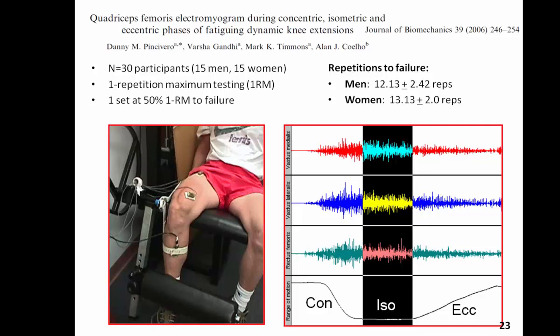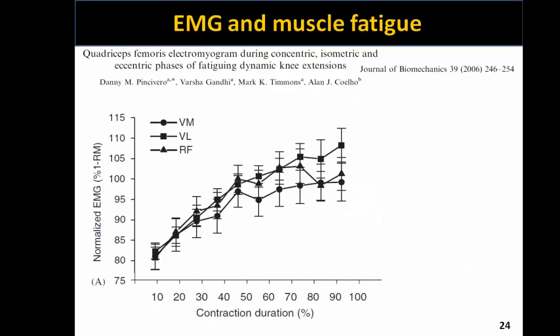So the first observation to make here is that we see a relatively large burst of EMG activity from the 3 superficial quadriceps femoris muscles as the knee goes through knee extension, held fairly consistent throughout the isometric phase, and we see relatively lower amplitudes as the weight is slowly lowered back to the start position because the need to activate the muscle decreases because the force output is augmented by the lengthening state of the muscle.